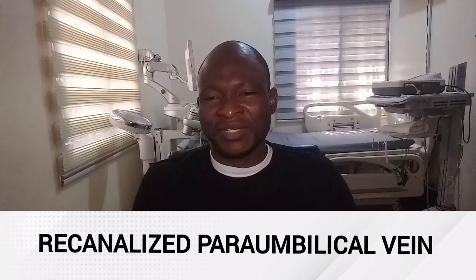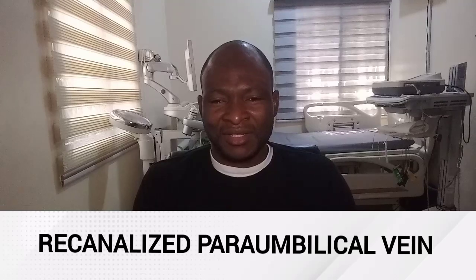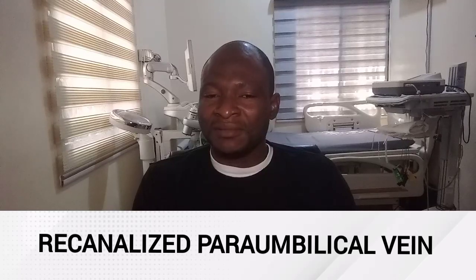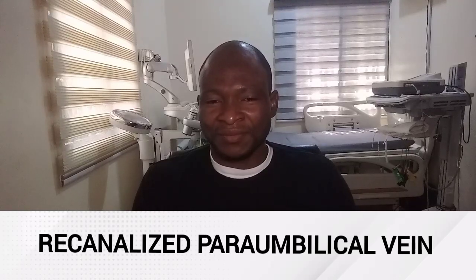A segment of remnant of the umbilical vein may be normally patent in about 16% of healthy persons without portal hypertension.